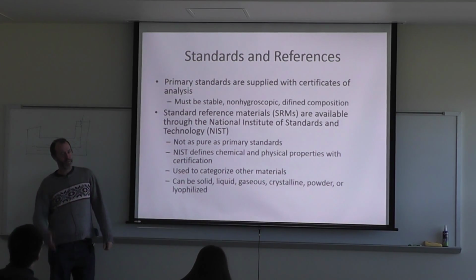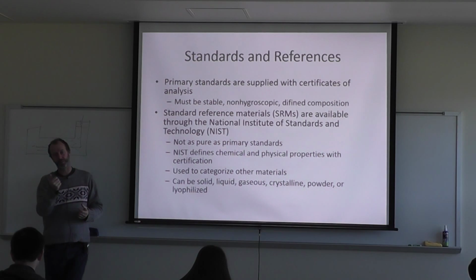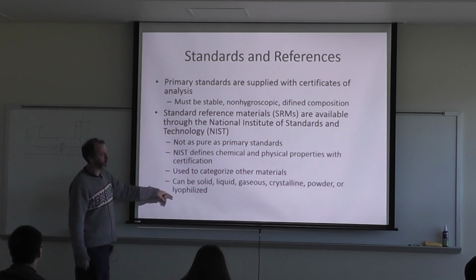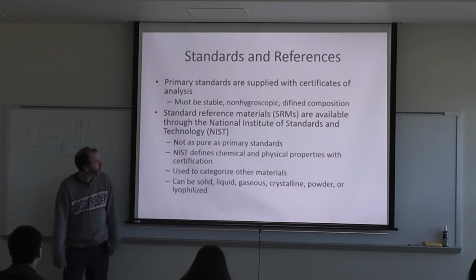You'll see a lot of the standards that we get with kits are lyophilized, or reagents are lyophilized. The enzymes and antibodies can be lyophilized, and you rehydrate them to the set concentration and then use them. Once you rehydrate them, they're not as stable as they were when they were lyophilized. So things are lyophilized for stability purposes. And you will see once we do the quality control chapter, you can use lyophilized control pools for making sure your lab's functioning properly.